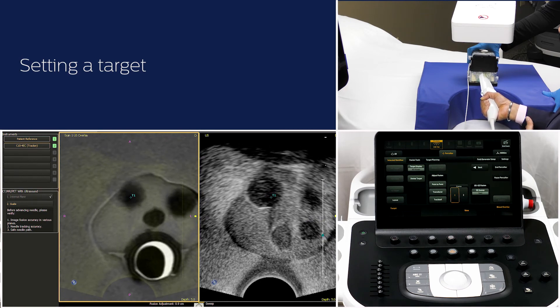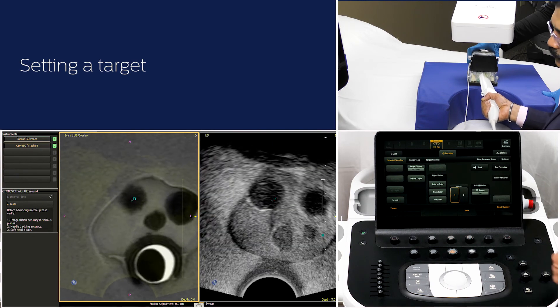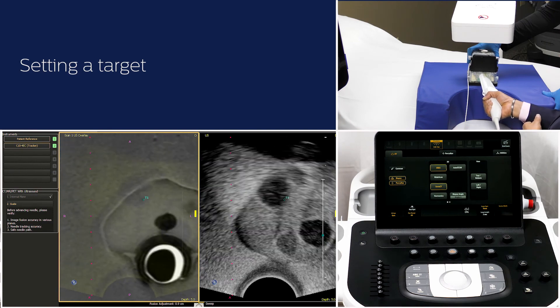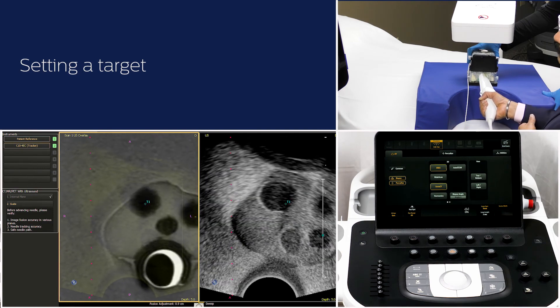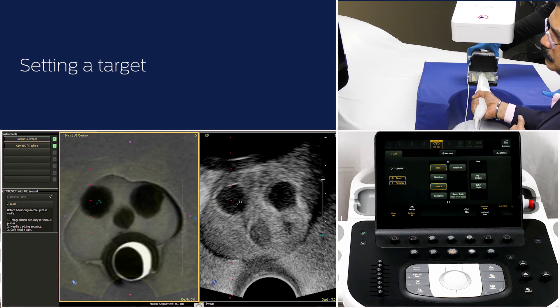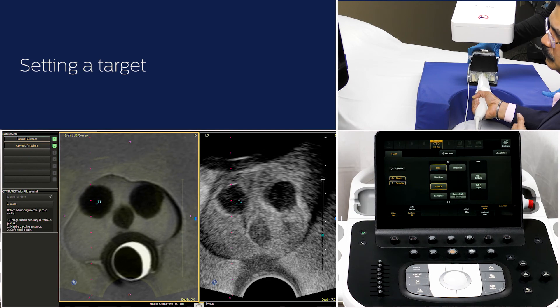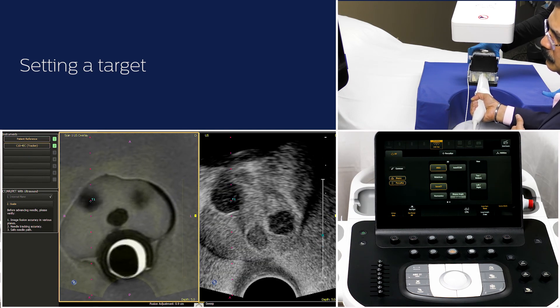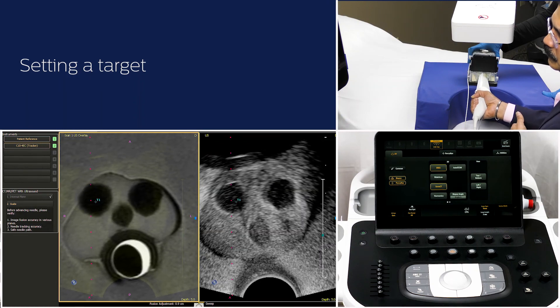Activate the biopsy line by going to the 2D tab. Align the target with the biopsy line and get the targeted biopsy sample of the lesion. One thing to keep in mind is you may have to turn the transducer left or right for better biopsy access while maintaining the same transducer pressure.